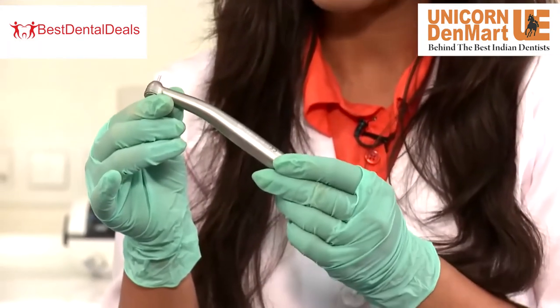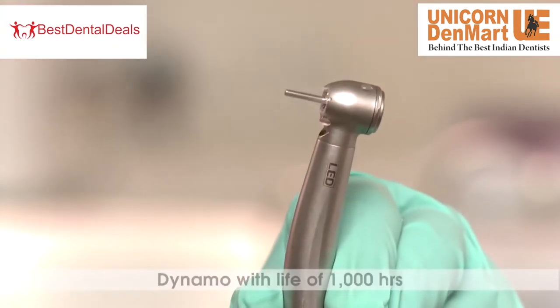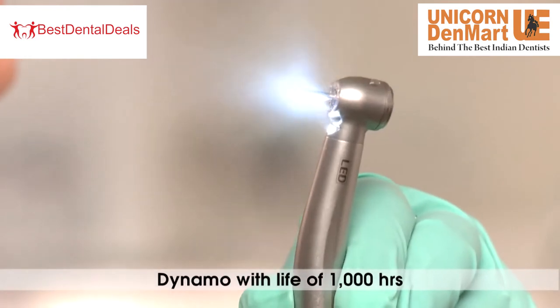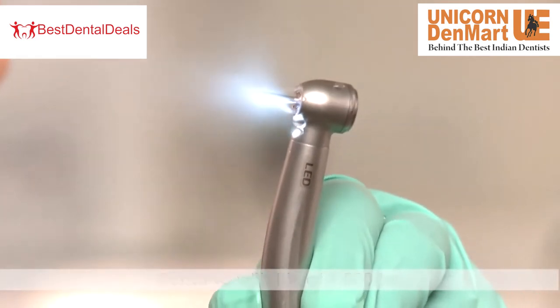Now let me tell you about the unique features of the Dyna LED handpiece. Made up of a durable stainless steel body, the dynamo with a life of 1000 hours provides continuous, uninterrupted superior illumination for a better view.